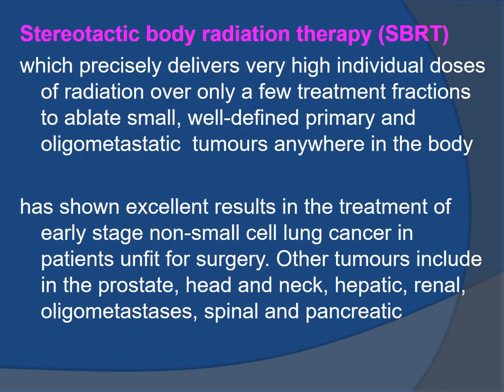So stereotactic body radiation therapy increases the therapeutic efficacy because through it we can give high doses of radiotherapy in a single shot or 2 shots.